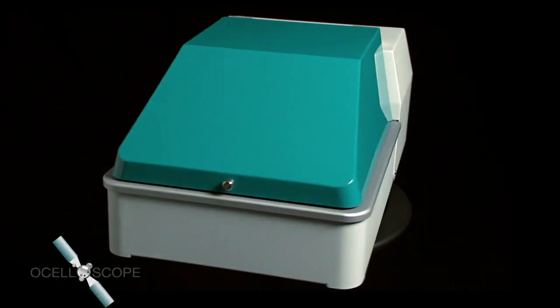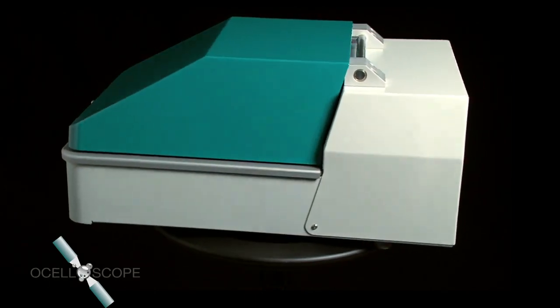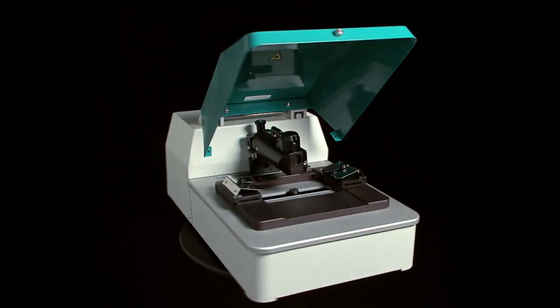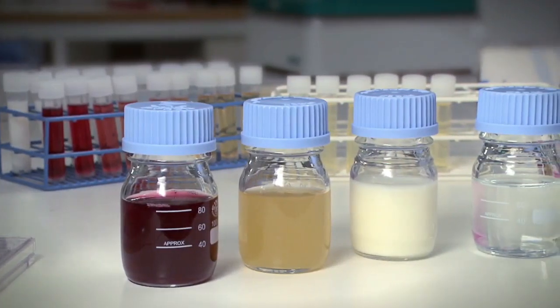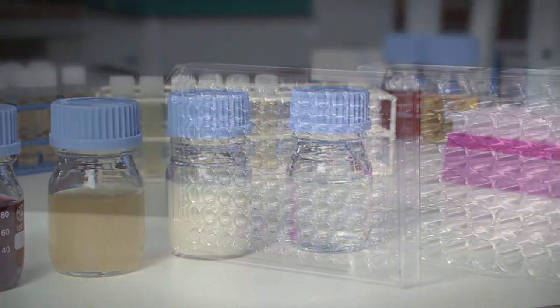oCelloScope is the newest state-of-the-art instrument for measuring bacterial growth, among other things. The results can be read much faster than all other known methods, something that's vital in connection with determining antibiotics resistance. Measurements can be taken from various different samples such as blood, urine, milk and water.